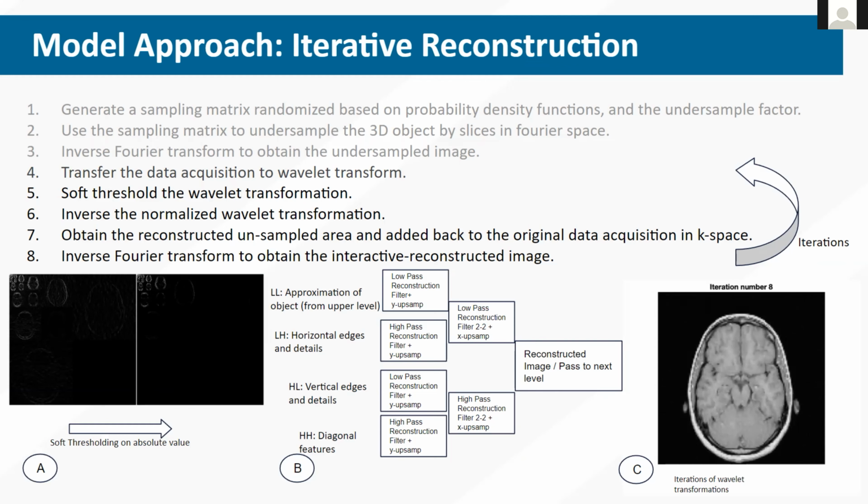The result is then used with the inverse undersampling filter to retain the details that the undersampled image lost, and then it is added back to the undersampled image. By doing this, an L1 norm is complete, but to minimize that norm, we do iterative cycles of it. Figure C shows a 30-step iteration process, and the outcome is actually pretty good after 10 cycles.